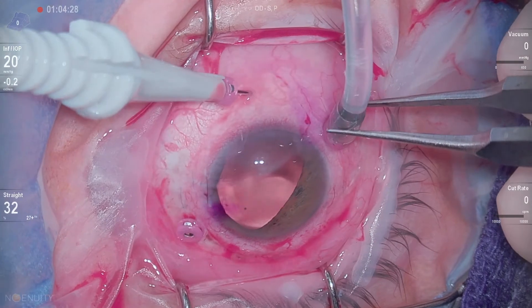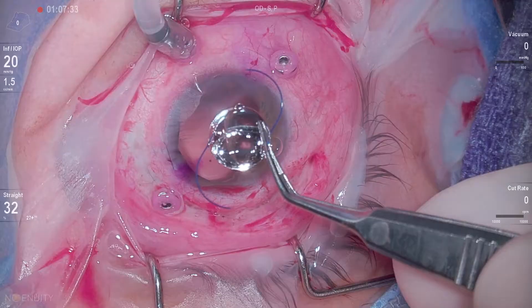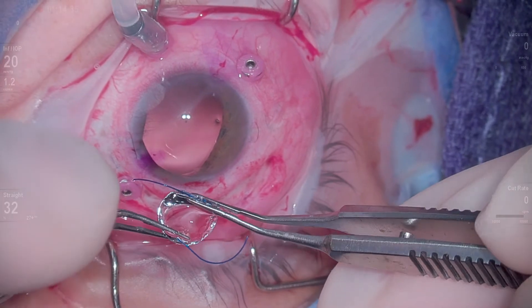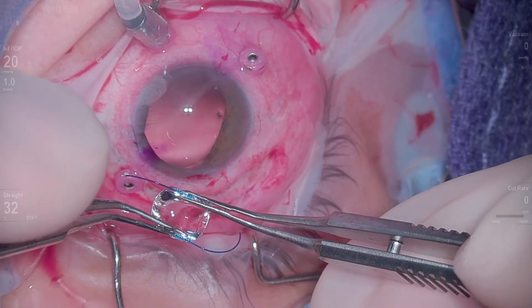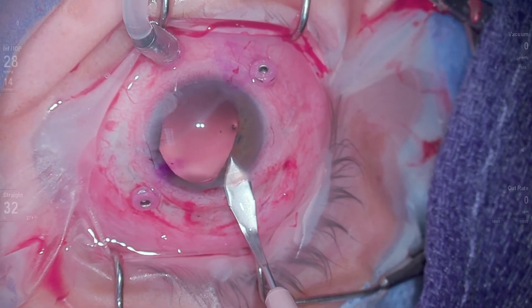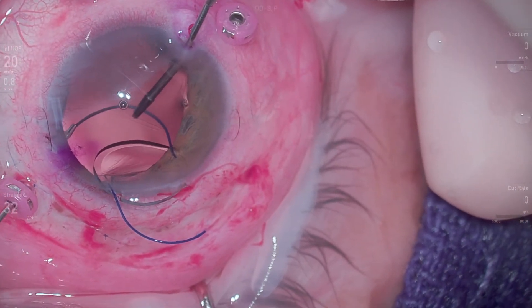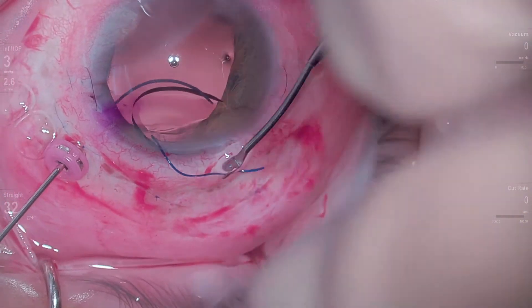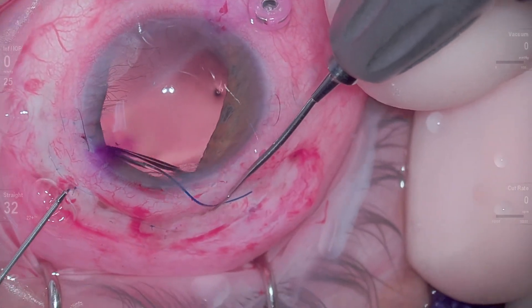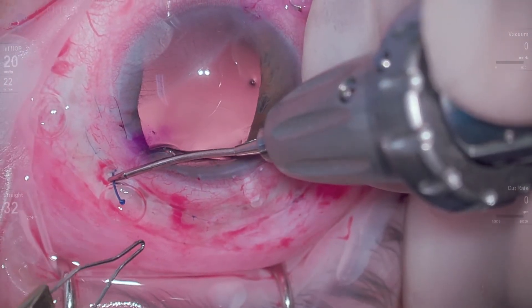Now this is where things get tricky. This patient was under general anesthesia and unfortunately had a leak around their LMA, so their CO2 levels were starting to go up. Anesthesia said we basically had one chance to get this lens in. This is the Zeiss Lucia lens — I really like it because it's almost unbreakable; the haptics don't separate off from the lens and they don't kink. One thing I should have done is had this lens in the warmer, because it really didn't fold well, and we'd previously had a haptic get caught in the injector with this lens, so I was just going to fold it — but it wasn't warm enough.